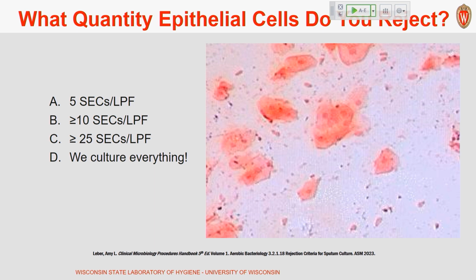But yes, is there a question? Yes. So we actually use a scoring criteria. White cells greater than 20.